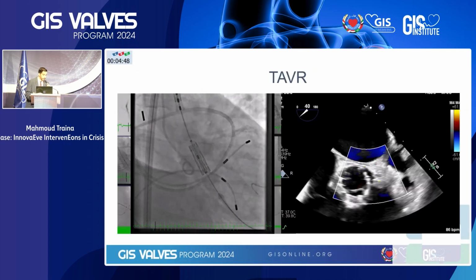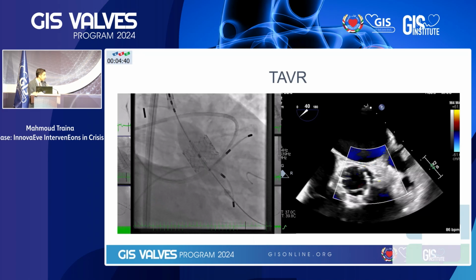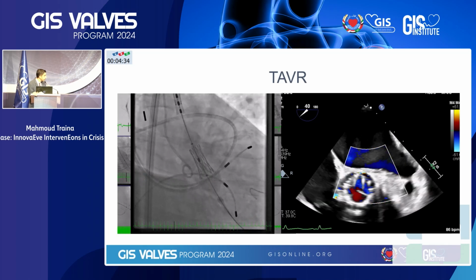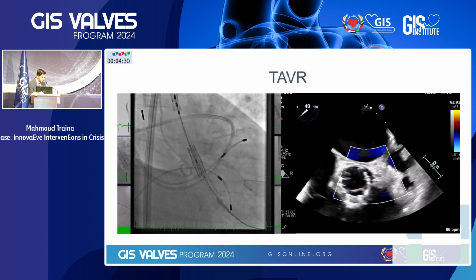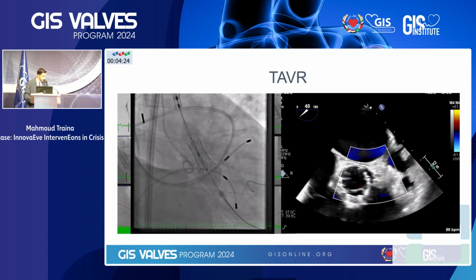All right, so our team agreement was similar. We felt the mitral regurgitation was the main physiologic problem, but fixing it without treating the aortic valve at this time would be a problem. So we planned for both with a decision tree after doing the TAVR. Sorry, I don't know why the slides keep going ahead by themselves. So the TAVR went straightforward with the Sapien valve, 23.